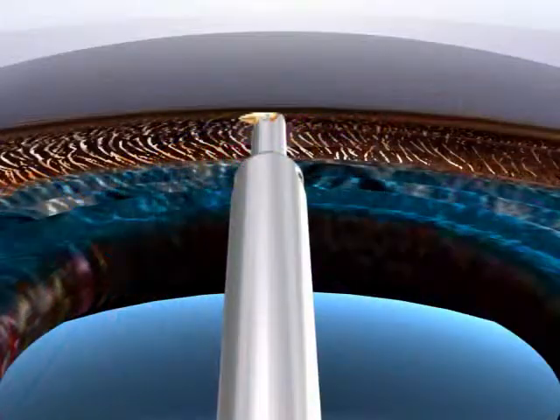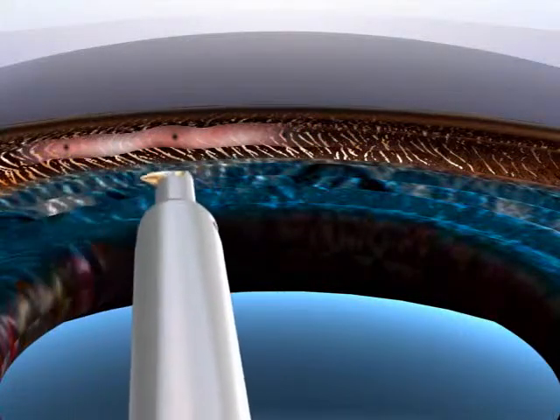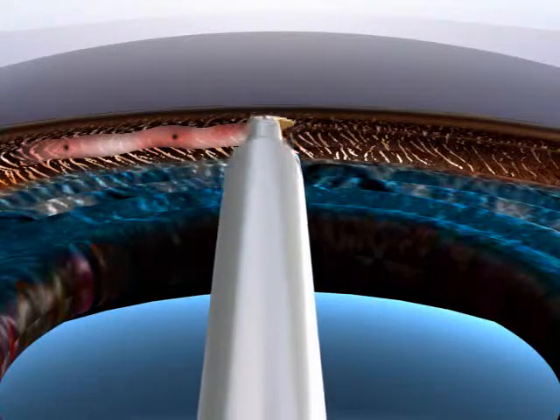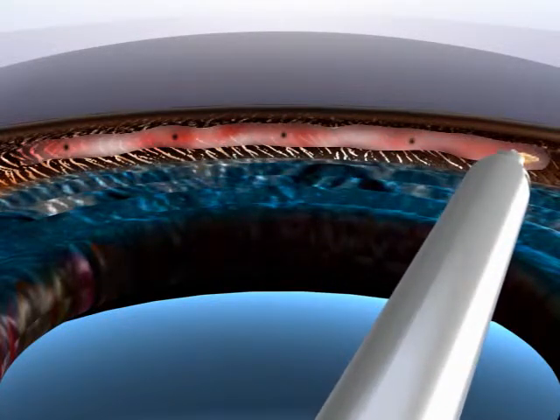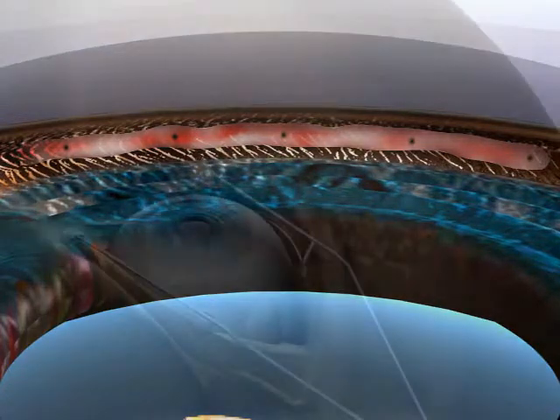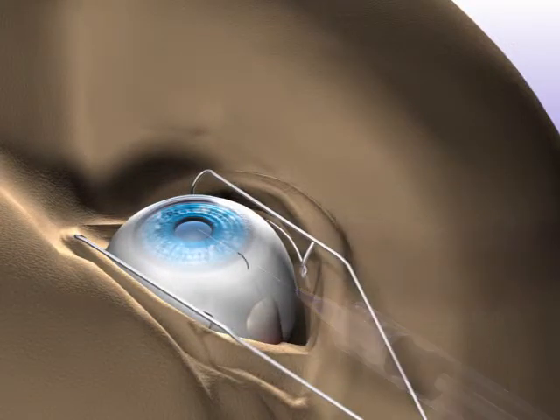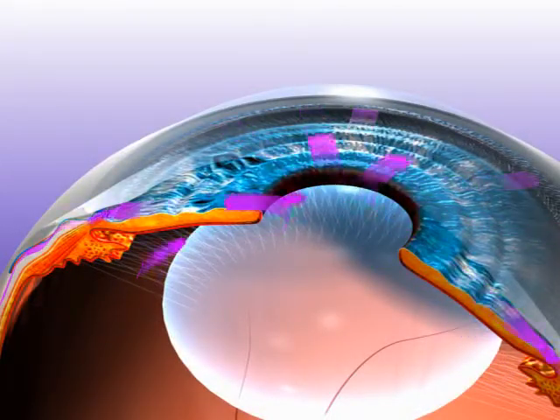The sharp tip is inserted into the trabecular meshwork, and then the handpiece is rotated first in a counterclockwise direction and then turned over 180 degrees, and ablation is performed in the clockwise direction. Note that there is some reflux of blood from Schlemm's canal and opened collector channels. Finally, there's irrigation and aspiration of viscoelastic fluid and a corneal suture placed. Theoretically, this then reestablishes outflow through the normal trabecular meshwork and Schlemm's canal outflow pathway.